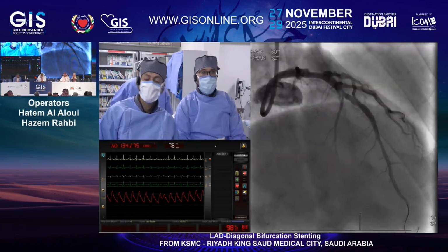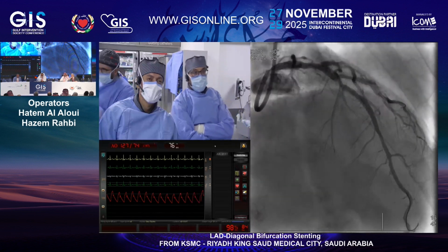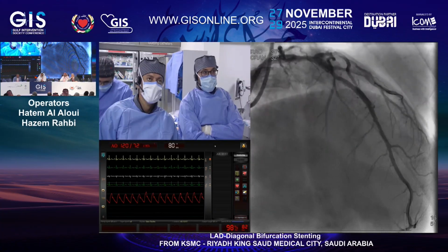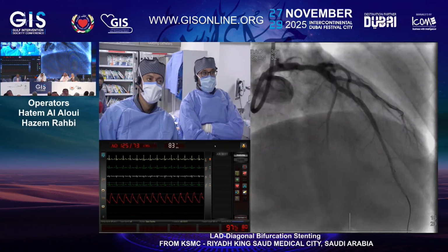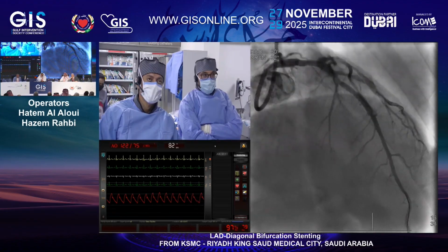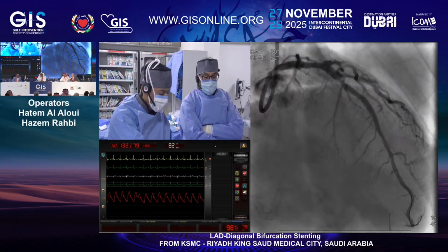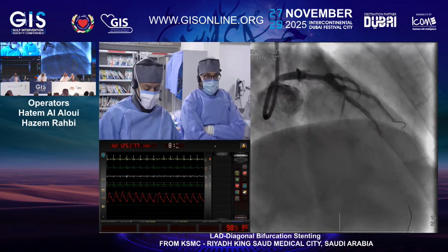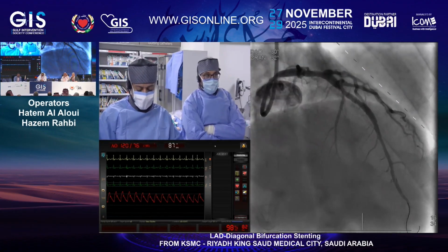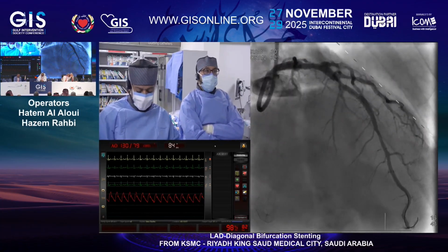I think I agree with you, Abu Harun. Dr. Hatem, I agree. I think you stent and then you assess, because if you really want to go healthy to healthy, you're probably going to end up using 2 stents anyway. So I would go with a shorter stent, assess on IVUS. If we're happy with the result, good landing zone, less than 50% plaque burden, probably leave it and follow him up closely. Otherwise, yeah, minimal overlap.